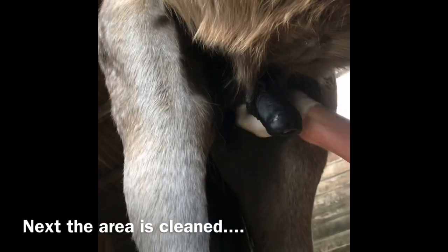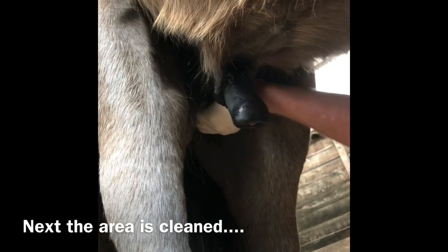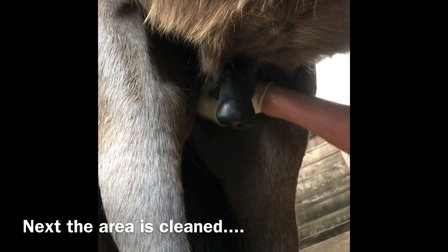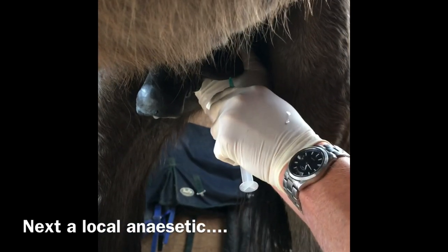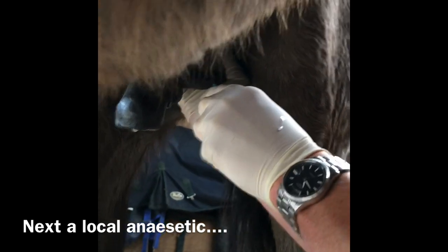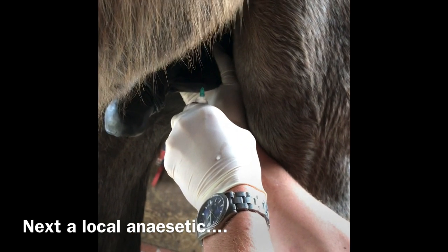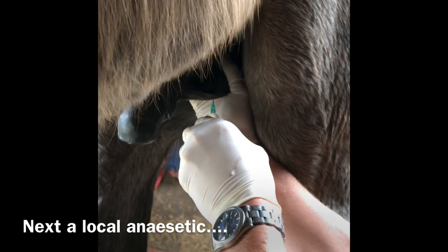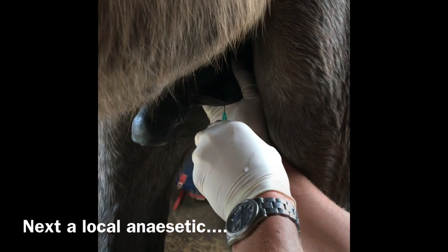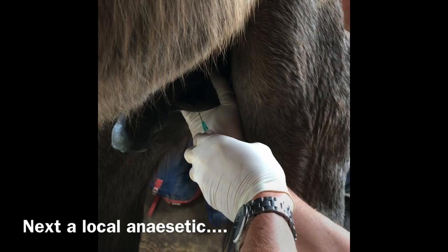Do a little clean, and then we'll chuck some local anesthetic in, so just get a bit of a pre-clean and then a bit of spirit after that. I'll just keep drawing, and that's obviously just under the skin there, so a nice blood where you're going inside.